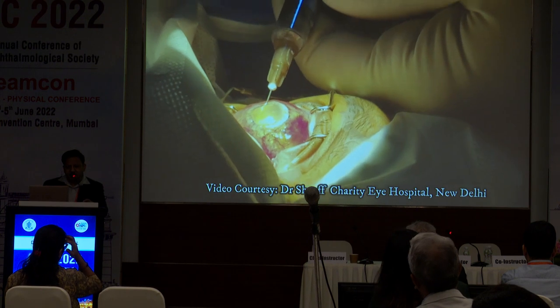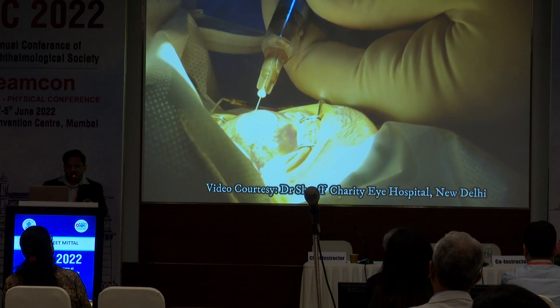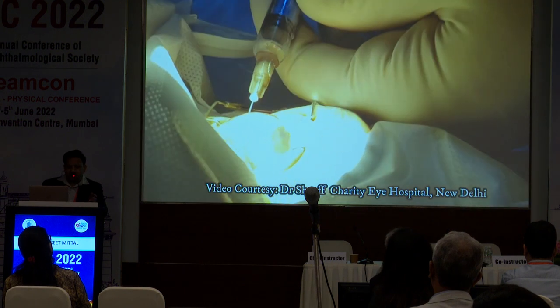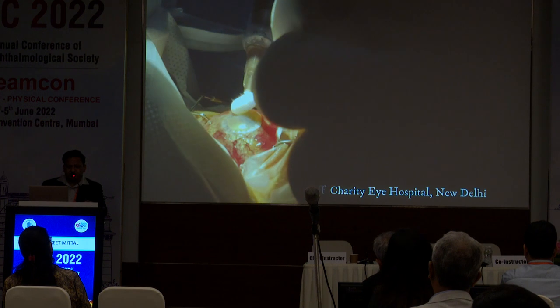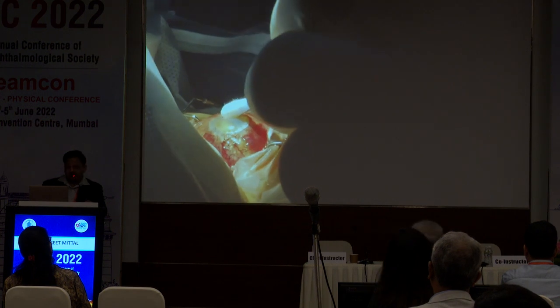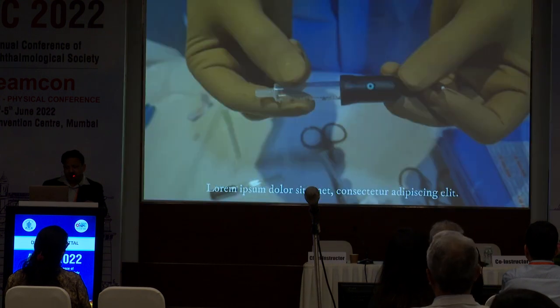But many times this gives us a report saying the quantity is not sufficient, because many a time we are not able to get a very good sample with this technique. So a small modification that we can do is this.